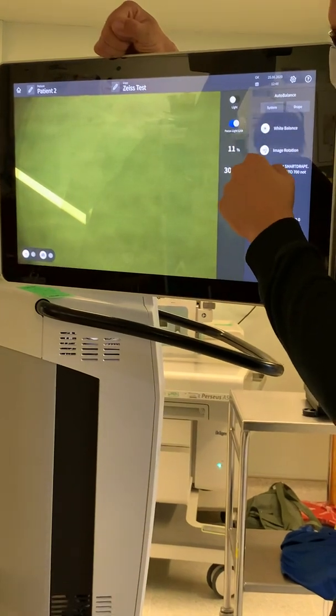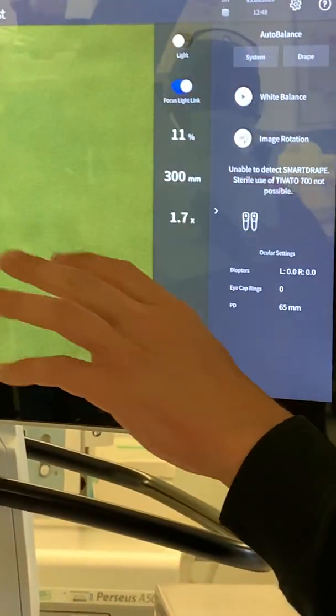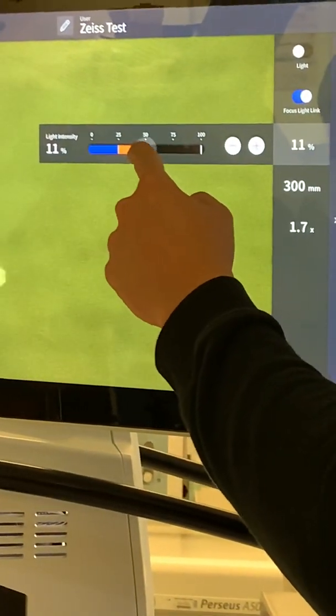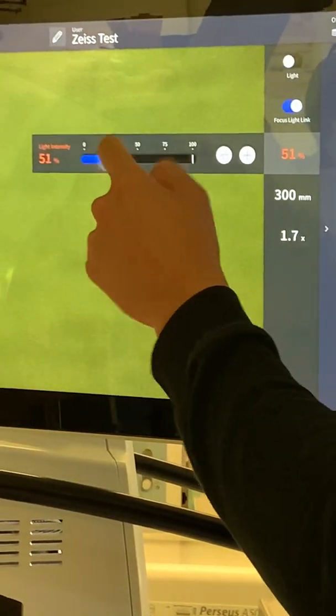This is your light percentage — the only parameter out of light, focus, and zoom that you can control through the screen; everything else is surgeon-controlled. Press it once and a tab comes out. If the surgeon asks for 50% light, slide it to 50 and it will go to 50.